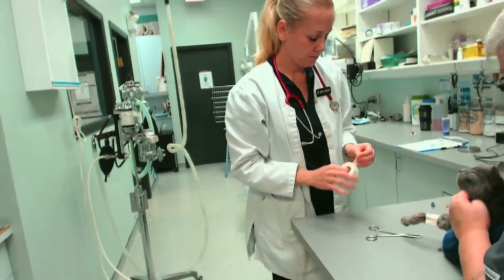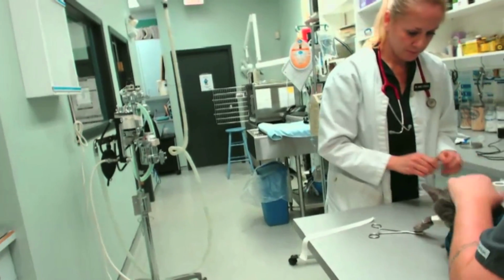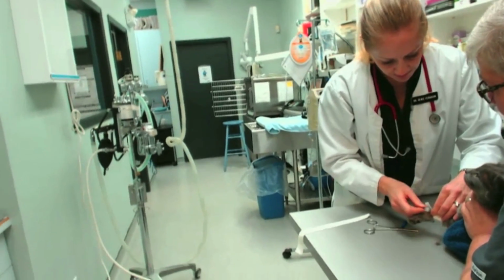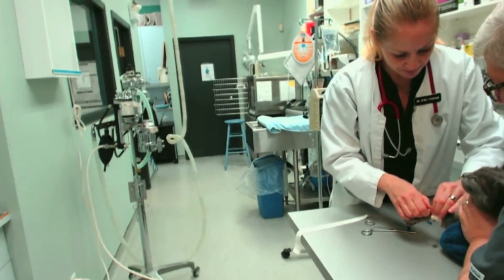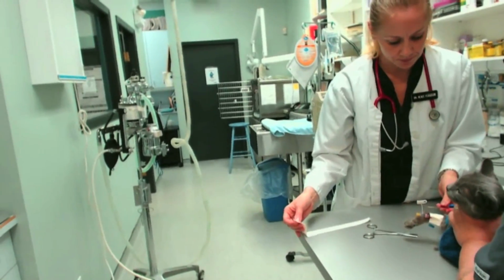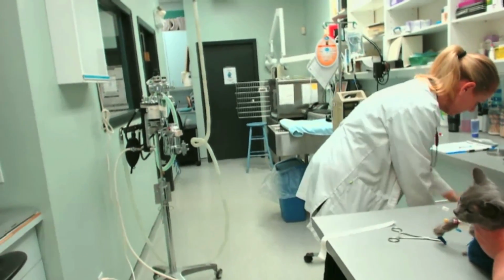That makes sense. Let everybody see that you're wide awake. Do you want me to just tape it like that? Yeah, or sometimes that's where I put the little bit of vet wrap on. But I like to have that taped up so that it's not flopping around. That's what scares them sometimes.